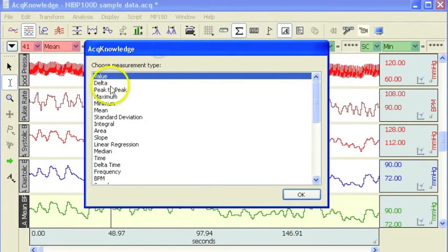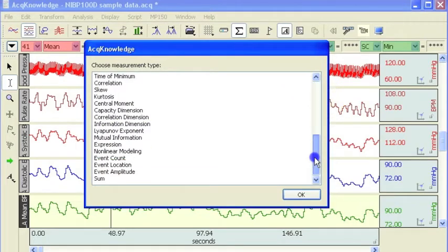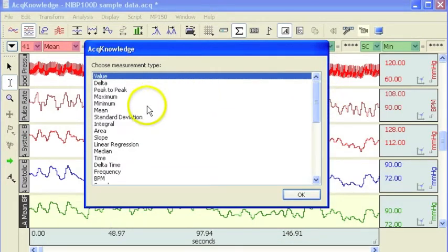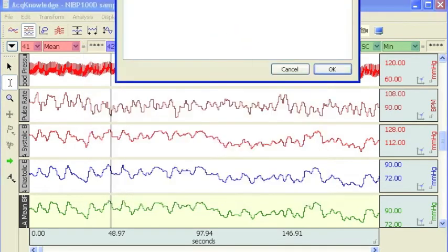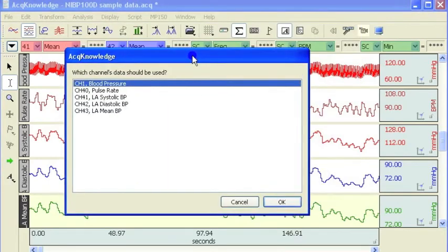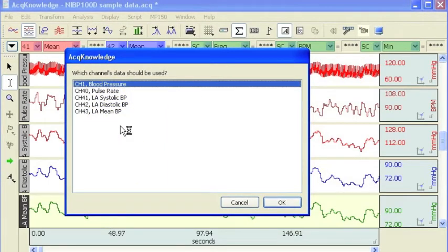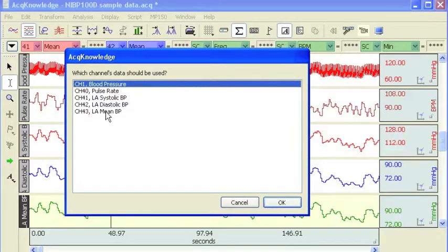Basically, you have the same list of measurements that are available from the pull down measurement boxes that appear above the graph window. If I just select mean, we're then asked to choose the channel we want to take the mean value from. I'm going to select the mean blood pressure, so we'll get the mean of the mean blood pressure over a 10 second period.